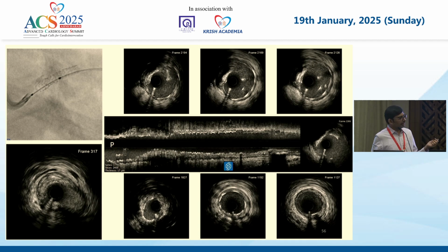So this is an example of a deformation. You can see that there is some deformation in the ostial part, but the main deformation is happening in the shaft of the stent. Initially, our thought process after seeing this IVUS image was that we went outside the stent and came inside. We thought we would dilate it and put an additional stent. But you see that this is one case where stent boost gave more information than IVUS, to see that we are actually correctly in the lumen.